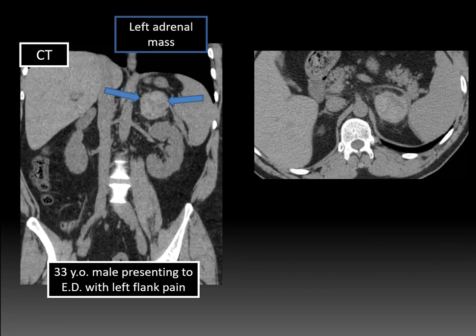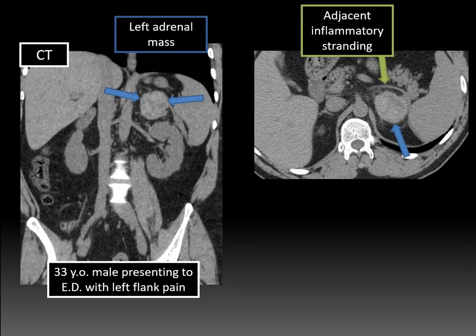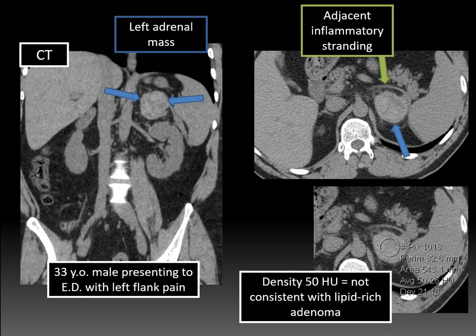Looking at the axial images, you can see the mass there with some periadrenal fat stranding denoted by the green arrow. That's due to fluid and hazy infiltration of the surrounding fat. If we measure the density of this mass by placing our region of interest down, we get a density of 50 Hounsfield units. The Hounsfield unit is the unit of density we use to calculate density on CT. And if you've seen the adrenal adenoma lecture, you know that this is not consistent with a lipid-rich adenoma — adenomas have a density of 10 Hounsfield units or less when they're lipid rich.